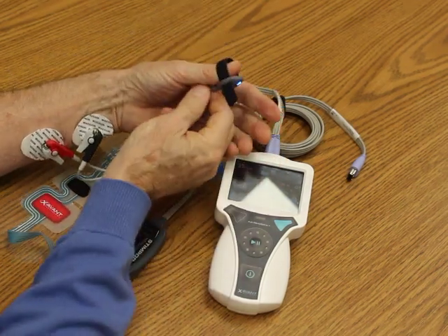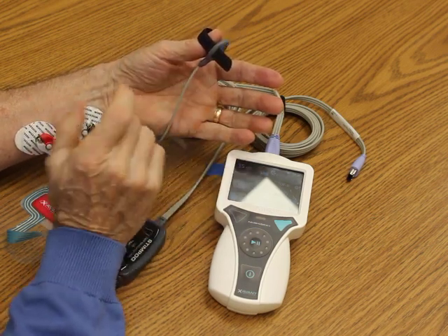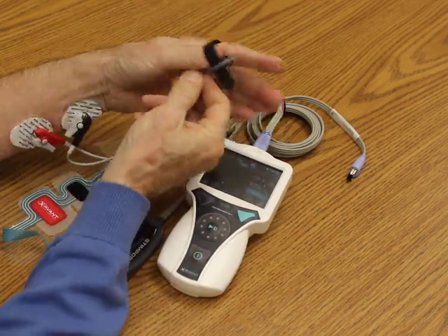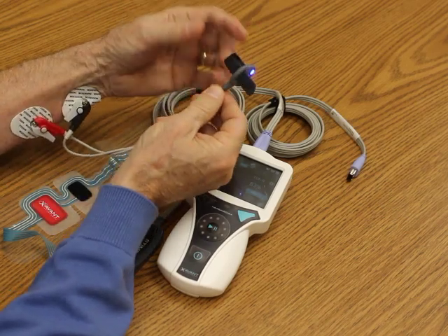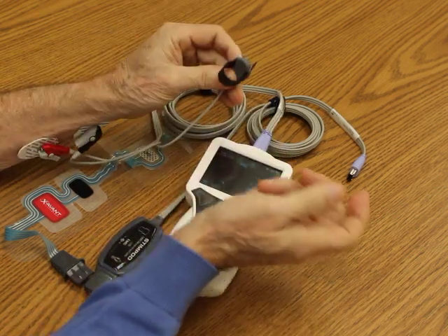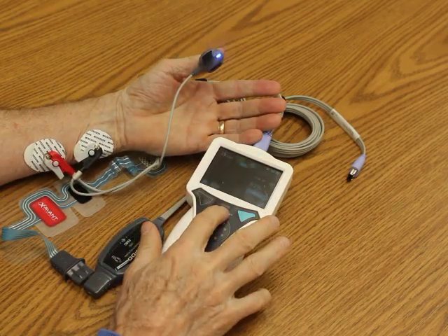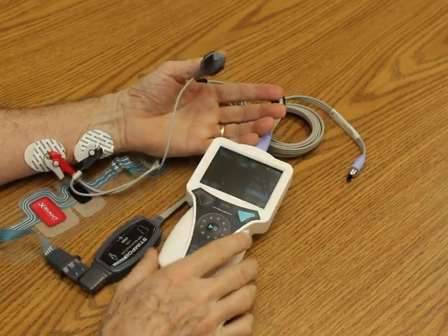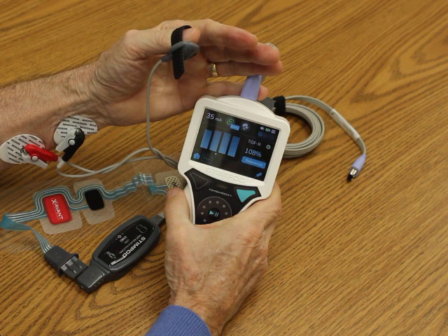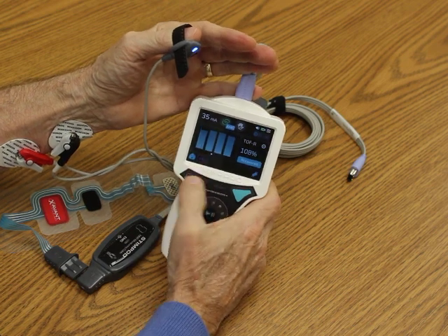I'm going to now connect this acceleromyography sensor. This is a fifth-generation accelerometer — it's three-dimensional and it self-calibrates every time you do a train of four. I can put it on the top of the hand, on the side, on the thumbprint, on the big toe, or I can take the strap off and put it on the facial nerves to do the eyelid or eyebrow. In this case I'm going to put it on the side so you can see the indicator light. You'll see the light turn green four times as I do a train of four — I'm at 108%, so obviously I don't have any paralytic on board.